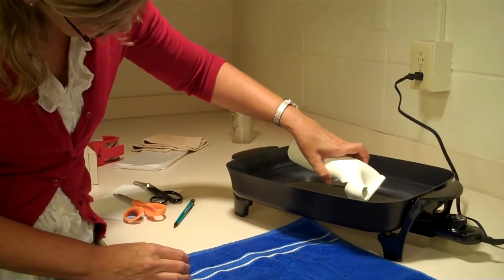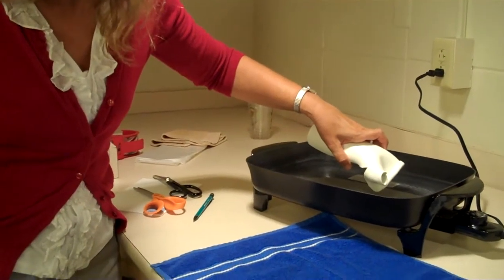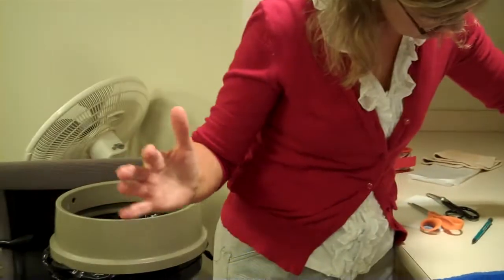So yeah, I think that's a good idea to roll that a little bit, because if that metacarpal head is buttoned up against that, she's not going to be very happy.